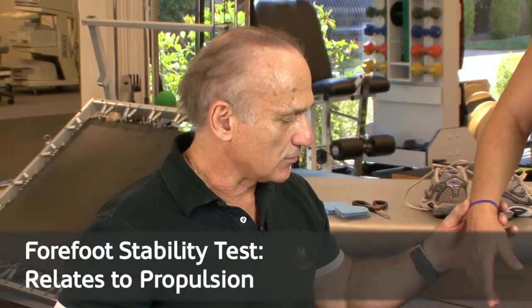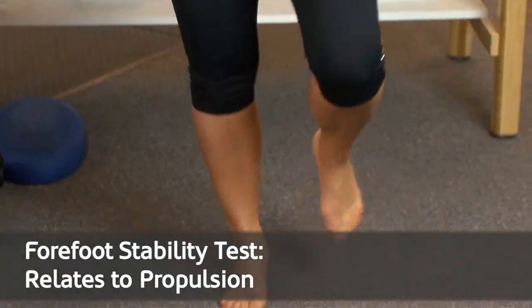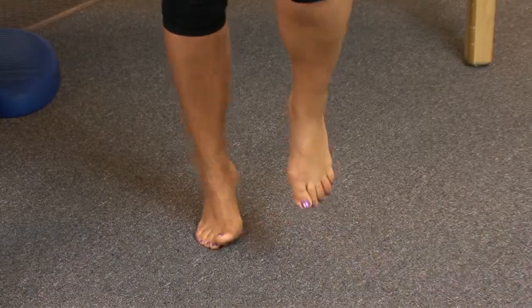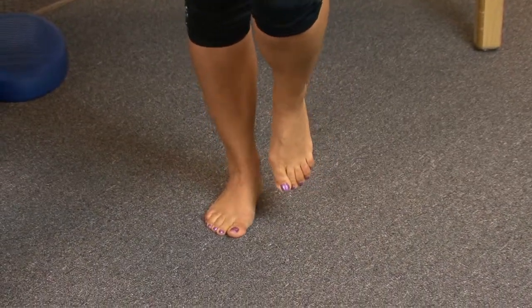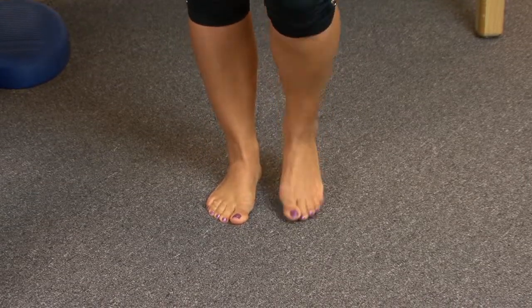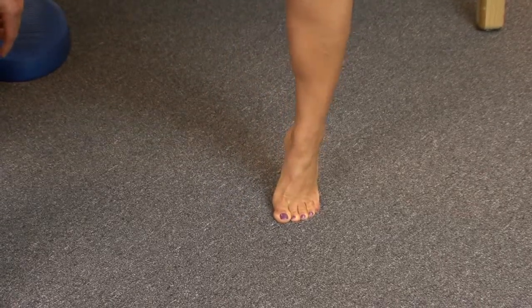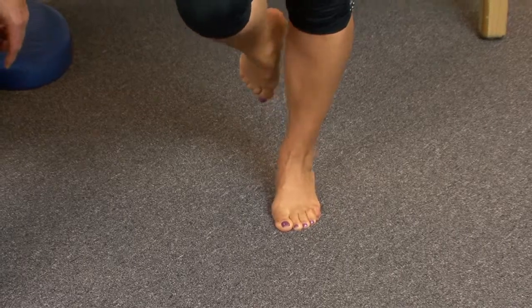Another test from the Formthotics company is the forefoot stability test. She balances on one foot and tries to rise up on her toes. You can see how difficult that is for her. We can say there is forefoot instability. Testing the left side as well, she really has all the characteristics of an excessive flat foot that would be very amenable to treatment with an orthotic device.